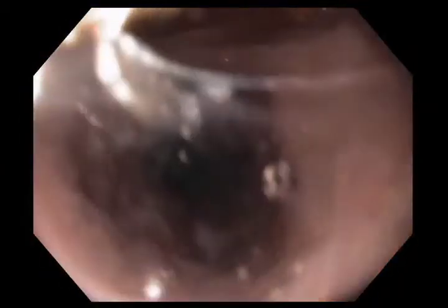We're now fitting the scope with the HALO-90 radiofrequency ablation device. We put it on to the end of the endoscope with a sleeve, and you can see it protruding from the 12 o'clock position — it's almost like a baseball cap. This is the device, twisted until it's moved to the 12 o'clock position. We're now intubating the patient; you can see the vocal cords we're passing by. Getting into the esophagus requires some gentle torquing back and forth to get the probe past the upper esophageal sphincter.